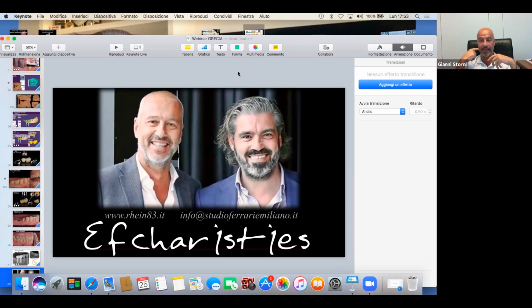We scan the design and we offer you the Equator, where you can even mix with some existing MUA. You can use one Equator, one MUA of Nobel, of Friadent, of Cide. So you can mix because both are fixed. Then you can also save some screws. You can leave out some screws if you have an aesthetic problem, and that is another big advantage.